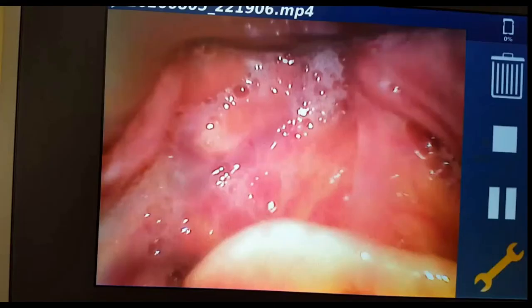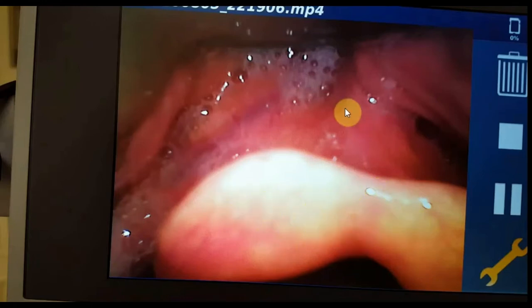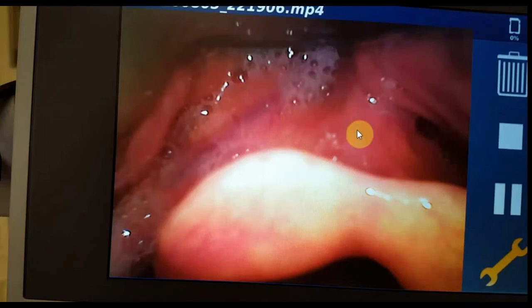Now in slow motion — there is quite a bit of secretion around the epiglottis. This area here is the epiglottis, and that is the vallecula. The midline should be here — that is where the ligament is.